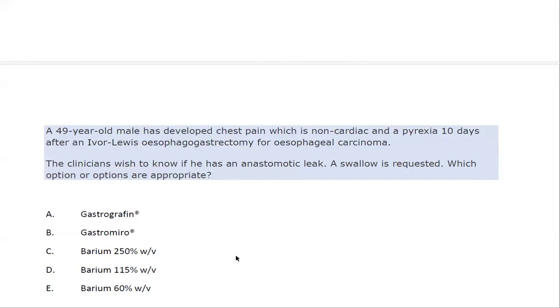The patient may need a surgical investigation, so they are telling you the patient may have a risk of perforation. Most causes of large bowel obstruction are volvulus or a mass, so most of the time it's high-grade obstruction, and you are worried about perforation. And even if there is no risk of perforation, there is a high risk that the patient will go to surgery. The surgeon can take some of the bowel if there is ischemia or something, so there will be a leakage of barium. This will cause peritonitis. That's why.